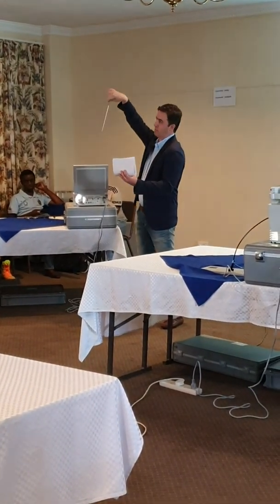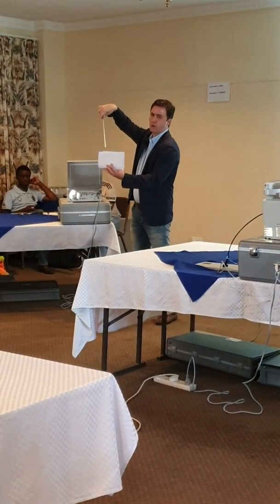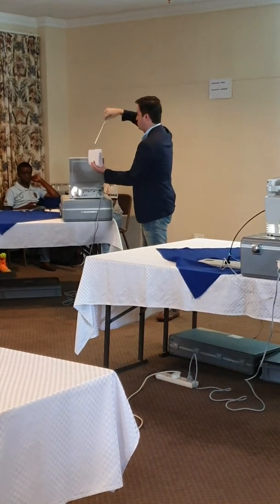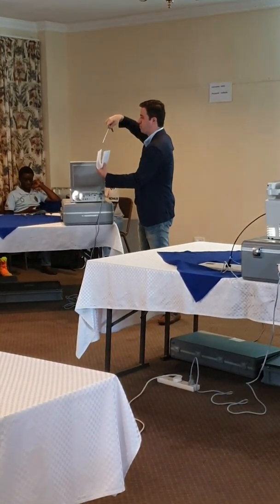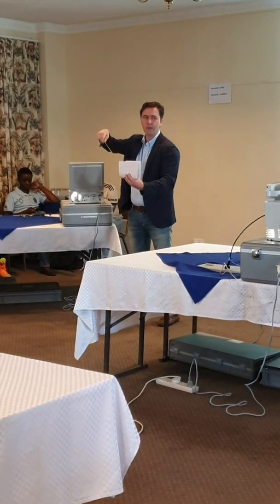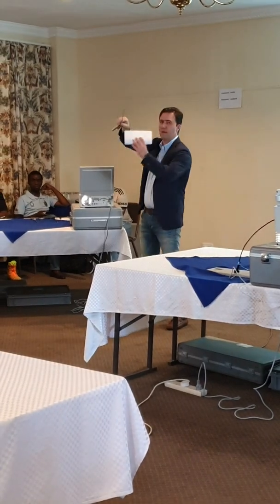So you have to understand this theory. If you're coming from this side and the wound is in this direction, it won't work. You have to correct the needle to place a nice suturing. So you also have to plan the way you make your incision. You have to correct this problem. Imagine that we are all inside the abdominal cavity.